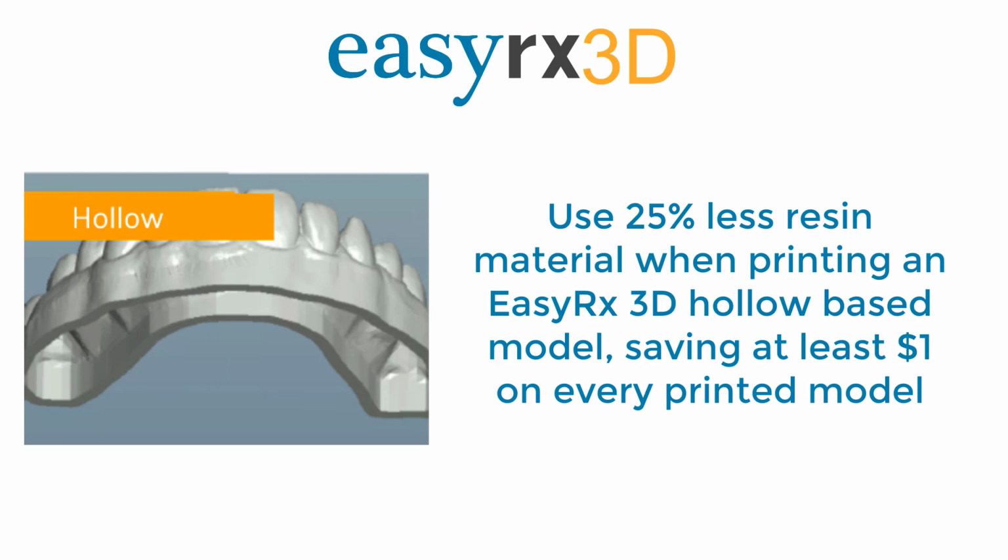EasyRx 3D supports hollow bases on models. We've been told by our 3D integration partners that EasyRx hollow models saves about 25% of the resin material when printing. So maybe instead of $4 a model to print and manufacture at your in-house lab, it's now $3 a model, saving you $1 a model. Think about how many models you print a month. There's some real savings in EasyRx 3D. These are just a few examples of the ROI on EasyRx. There are many, many more examples.